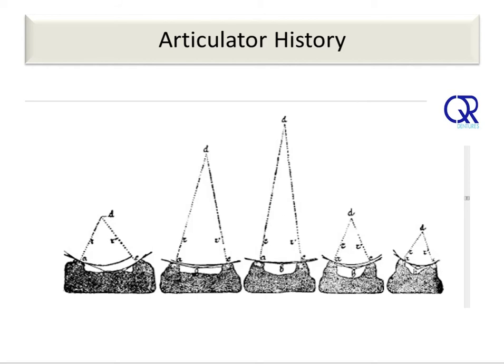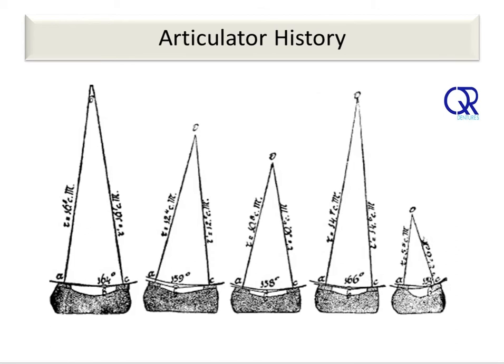Using cross-sections of dentulous mandibular casts, Frank demonstrated that there were vast differences among individuals in the curvatures of the occlusal planes. Frank repeated his simulated functionally generated path experiment using blocks made of a pumice stone mixture. The curved occlusal surfaces generated on Frank's blocks were remarkably more complicated than the spherical surface reported by Christensen.